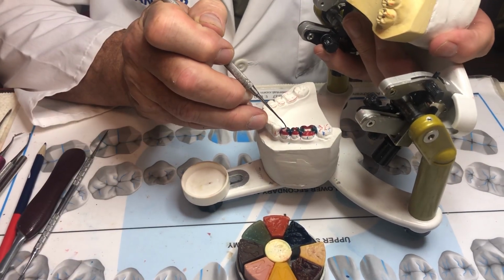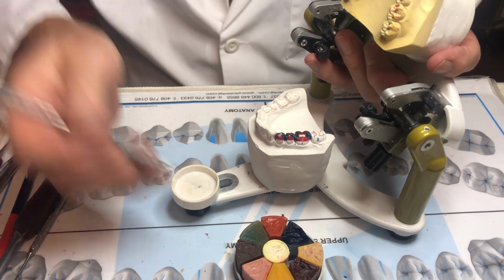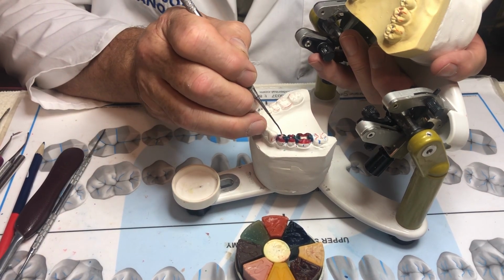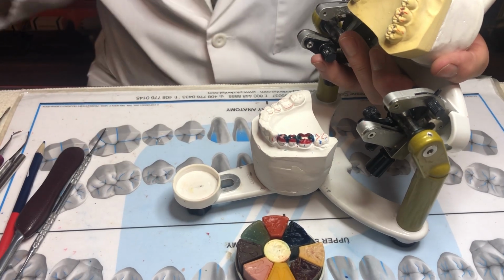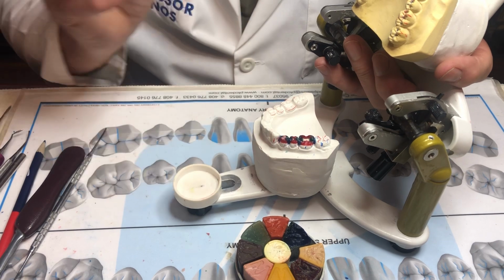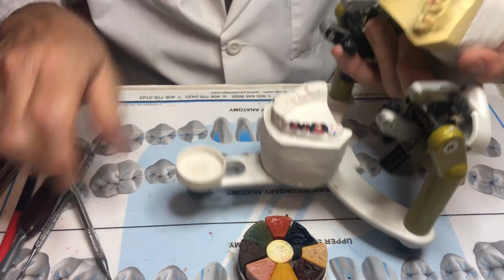And the lingual, as you know, on a mandibular first premolar, the buccal cusp is the bigger. The lingual one is the smaller. It is a non-functional cusp, so you do not see contact on the tips. You see a little bit of contact down into the center. So let's close it down. And there it is, just popped in.